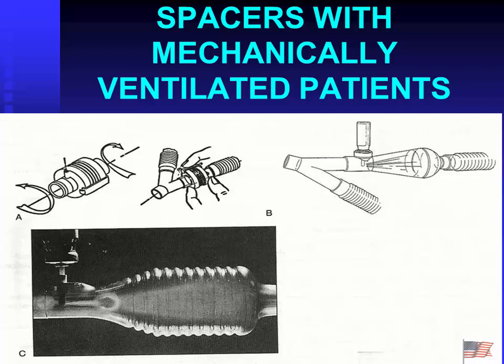When we get to mechanical ventilation next fall, we'll talk about proper placement of the nebulizer, and this is a huge debate, although there's been very good science to be specific about where we should place that within the ventilatory circuit and what kind of spacer we have. You can see the one on the left, letter A there. It's a spacer that actually collapses down and then expands for when you need to give the therapy, collapses back down again.